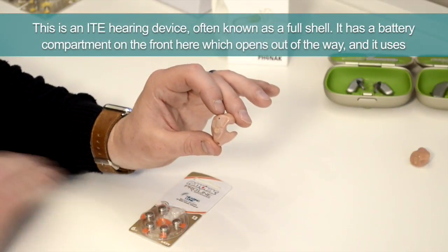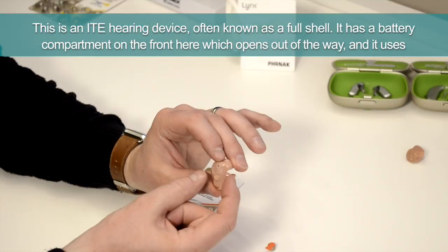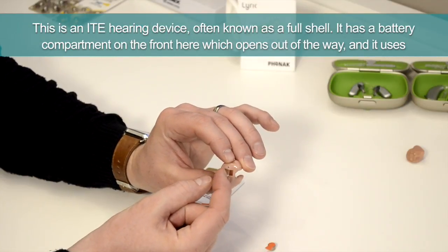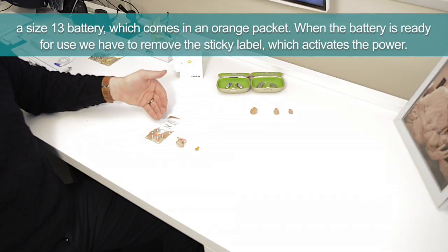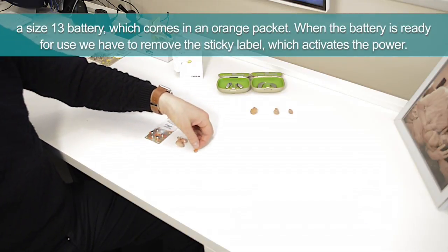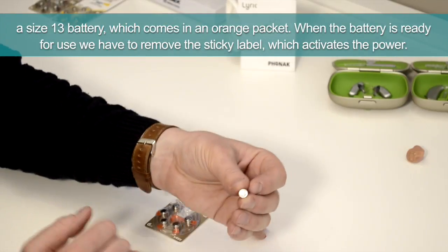This is an ITE hearing device, often known as a full shell. It has a battery compartment on the front here, which opens out of the way, and it uses a size 13 battery, which comes in an orange packet. When the battery is ready for use, we have to remove the sticky label, which activates the power.